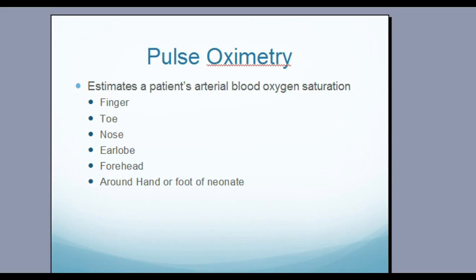I talked a little bit about pulse oximetry, and these are the areas where we can take our O2 saturation, our pulse oximetry. It can wrap around even for our little ones, their hands and the foot.